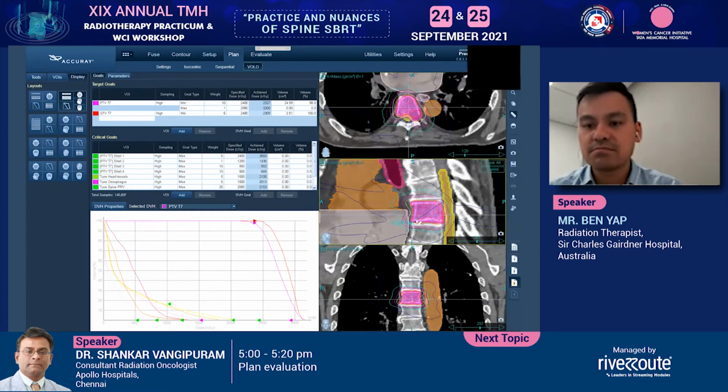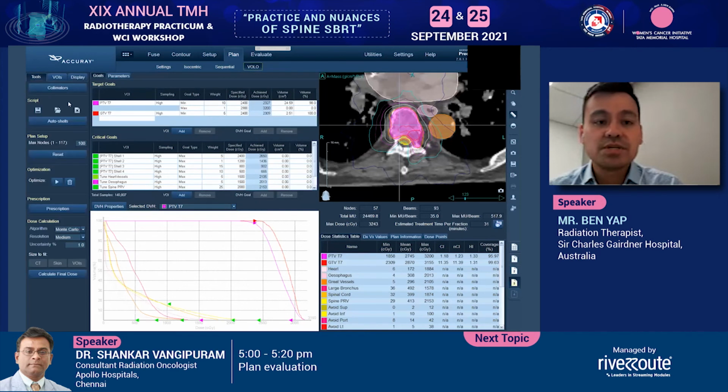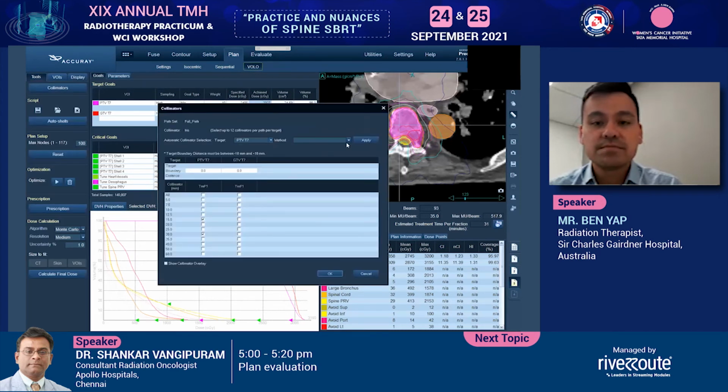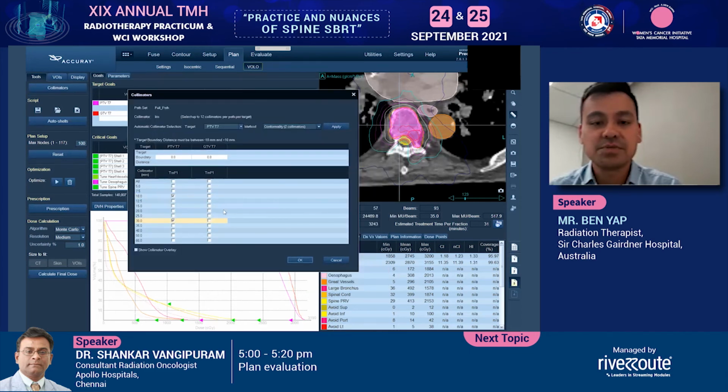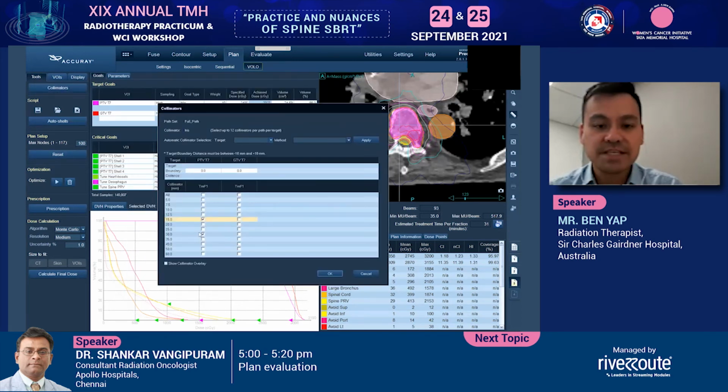Oh yeah, it's about 33 in this way, 20 in this way. There's, you know, a couple of small bits. Maybe you want a small collimator as well. Maybe I'll use a 12.5 because that's 11. You can do it that way, or you could just let the computer decide for you. And you can see it's gone for 10 and 30, which is not too different from the measurements we took. I obviously, what did I end up choosing? I chose something higher, went with 15 and 30, and it did a fantastic job.